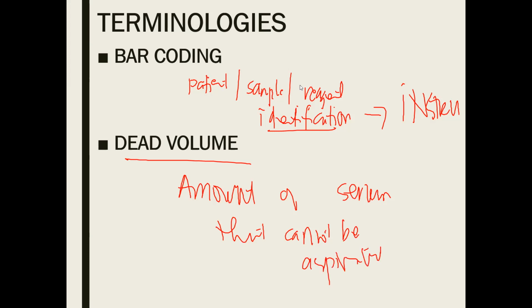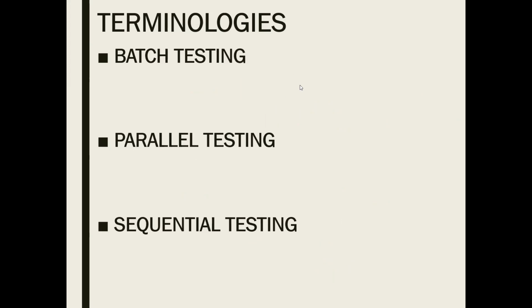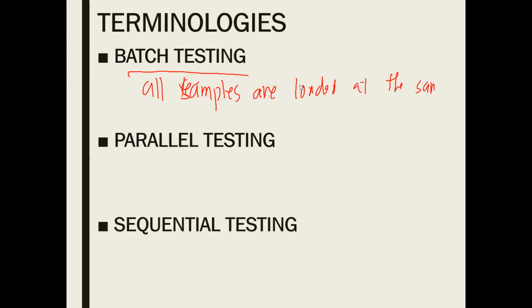Okay? Another term that we have here is your batch testing. Kapag po sinabi nating batch testing, all tests or all samples are loaded at the same time and a single test is conducted each time.